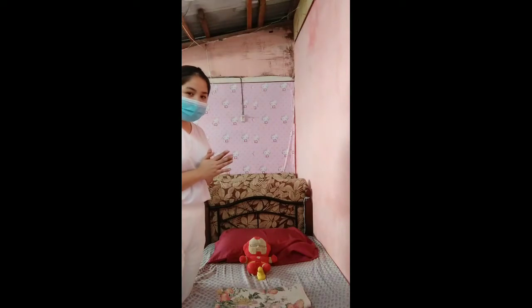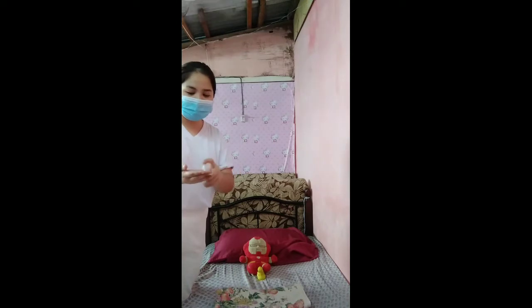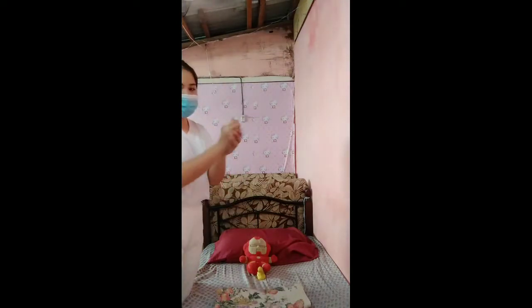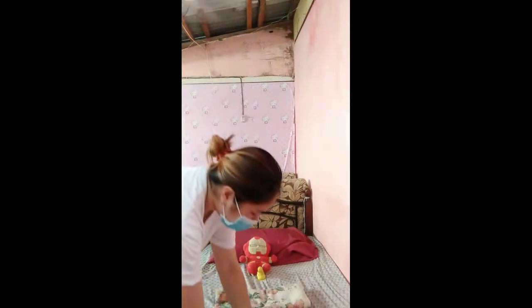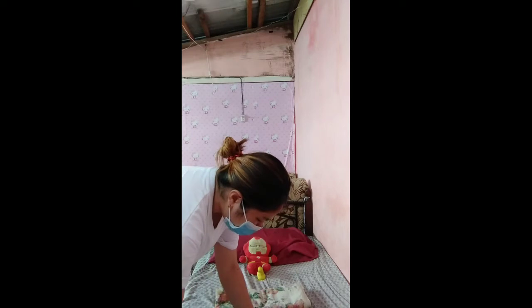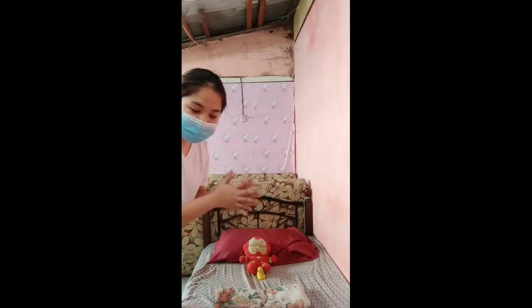After that, we need to perform hand hygiene. So I have here alcohol. After putting alcohol on our hands, we need to prepare the catheter for the procedure. After preparing the materials near the patient, we need to put on sterile gloves.